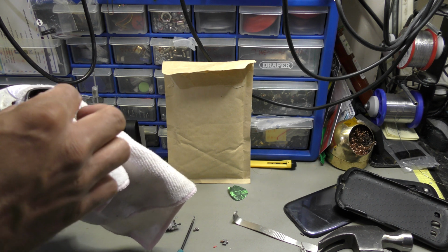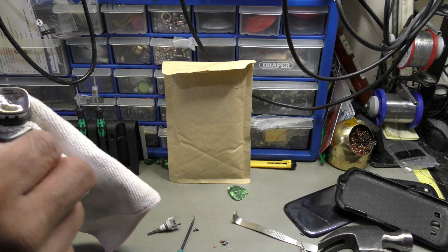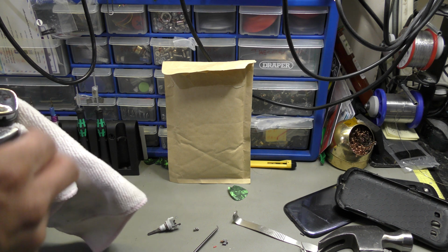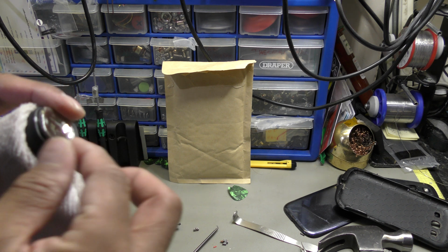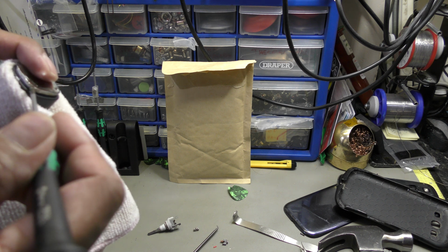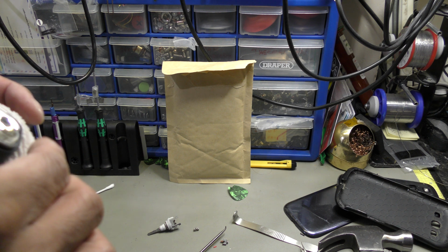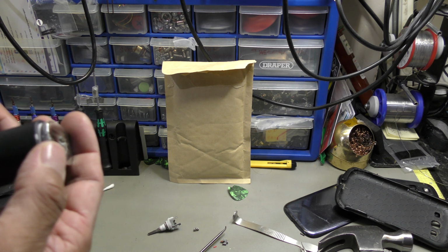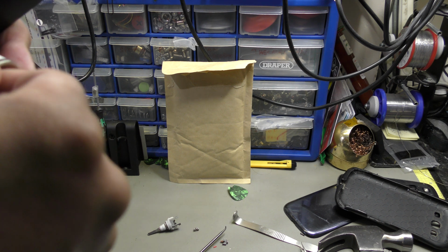Then the housing will open up at one end, and just grab yourself a nice flat screwdriver, a thin one, not too thin but fairly thin, and just gently pry up the casing around the edges. So start from like this, and go around and try to minimize the risk of damaging the rubber seal here, because otherwise the unit will not be fully water resistant. So that's something you do need to bear in mind.